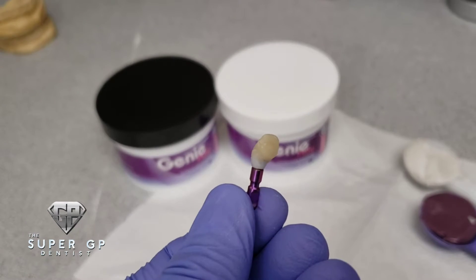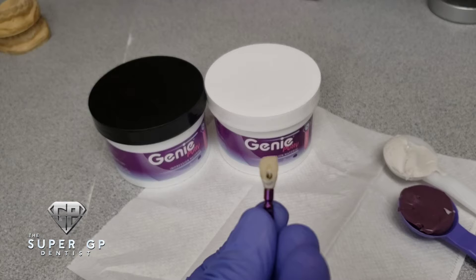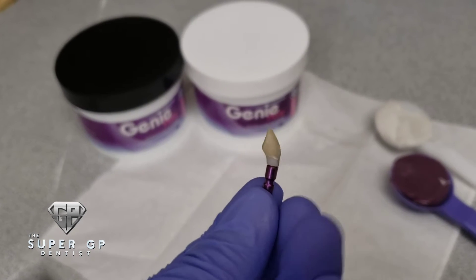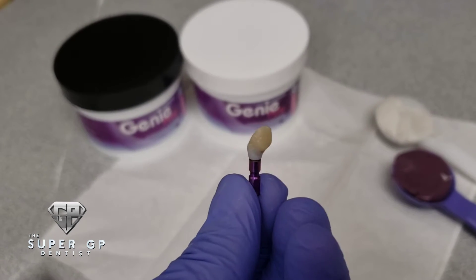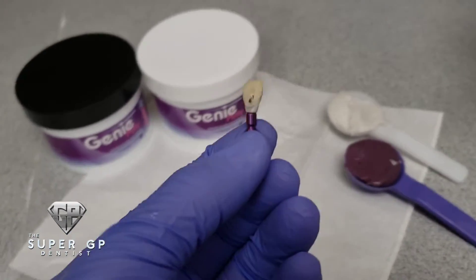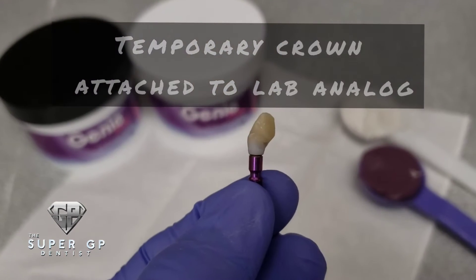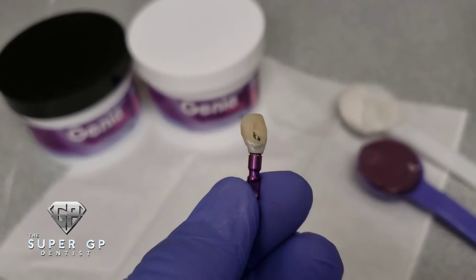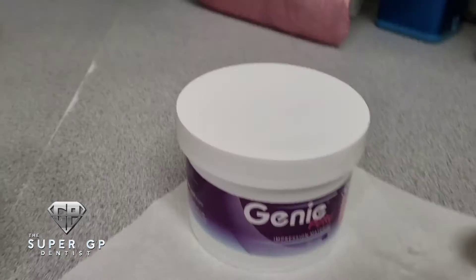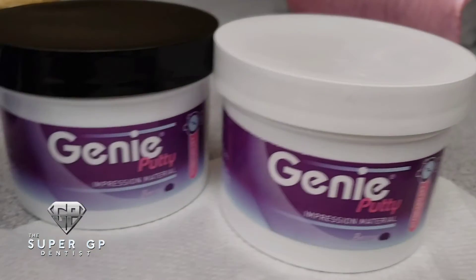The first thing you need to do is have a temporary that's already fabricated in the mouth that you're happy with — the way the soft tissue appears — and the patient is happy with it too. You're going to remove that temporary crown from the mouth and place it onto the lab analog. Here's a close-up showing it being fully seated into the lab analog, just like it would be on the implant.